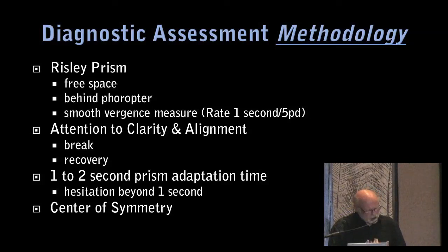So the big thing was that it was a smooth divergence range. It was a gradual increase in the prism demand. And when I start to increase the prism, I started saying, well, how fast am I moving this prism? It was about maybe 5 prism, in about a second's time, gradually increasing demand, just to give you a feel for how I administer these tests.